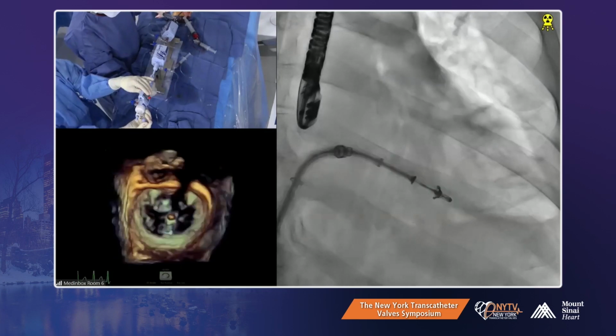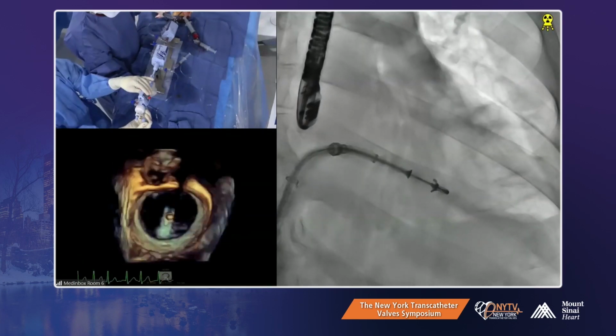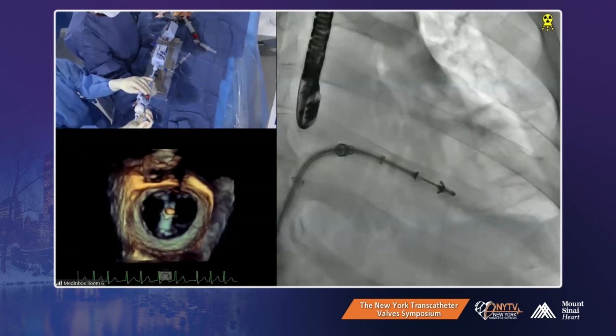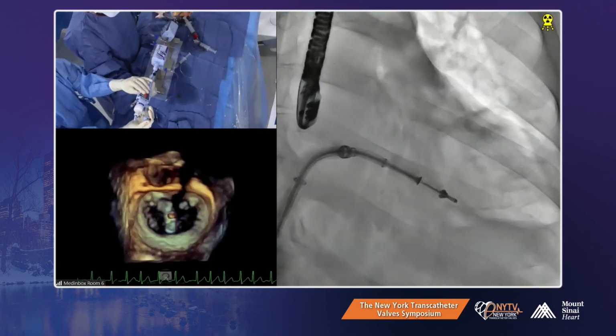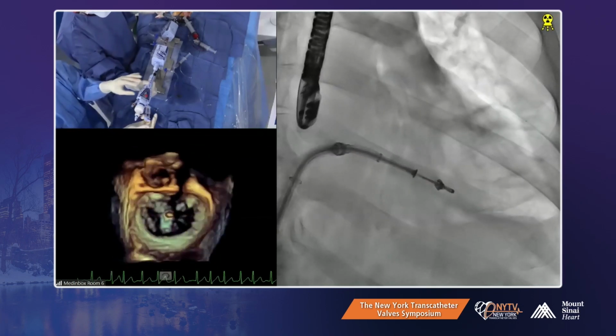Maybe a tiny bit more. Now it's too much, like 12:30. You see how that's too much? Now I think you need to come back 1 degree, and then I would go just a tiny bit more lateral. That's better. Where that's prolapsing, that's better.